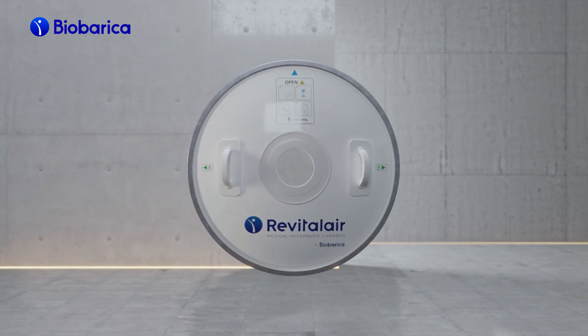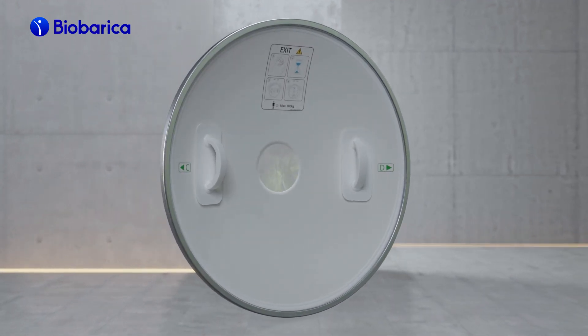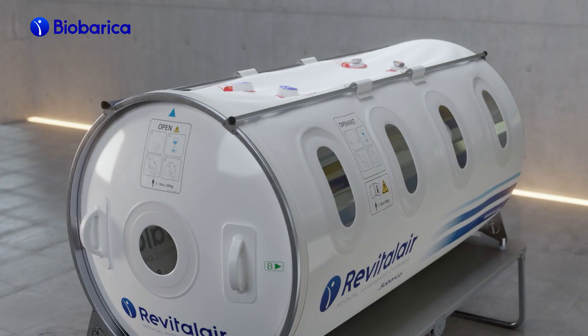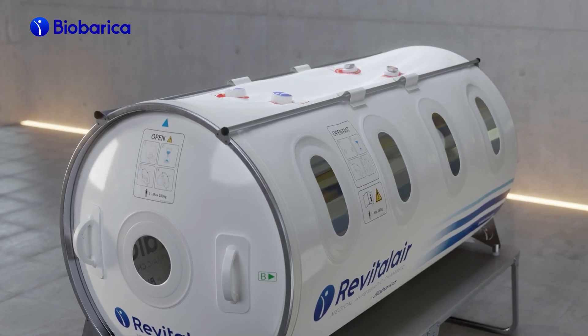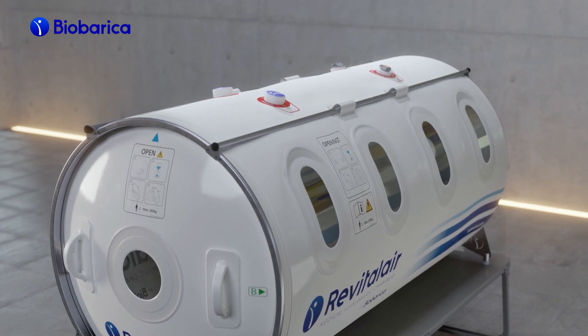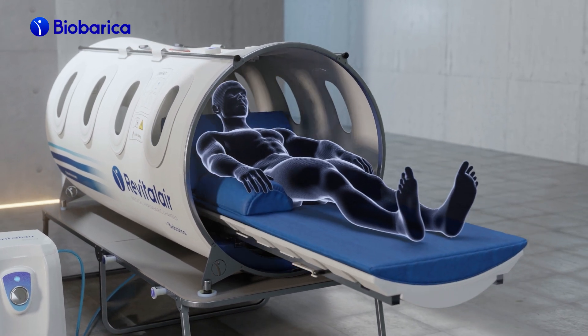The door also has external and internal handles for unassisted operation, creating a sense of security and peace of mind for the patient. The pressurization and depressurization of the chamber are the fastest on the market, completed in just five minutes. In an emergency, the patient can be removed in 20 seconds.